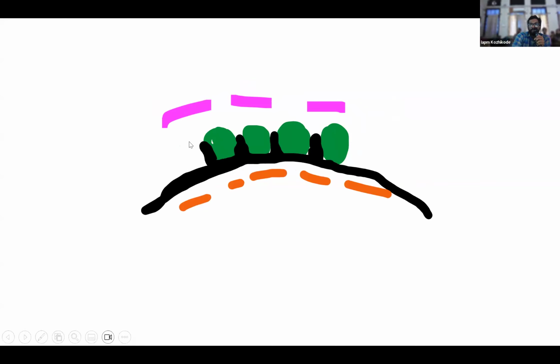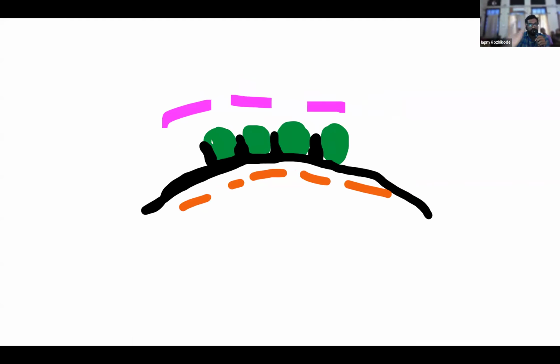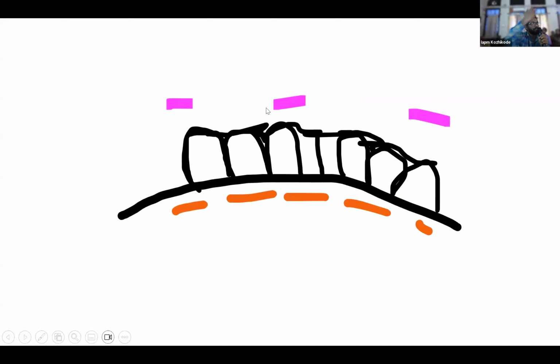It first starts as small outgrowths in areas. The first stage is just antibodies. Then small outgrowths start. Then they grow higher and completely envelop the deposits. And finally it would be resorbed, leading to vacant spaces.